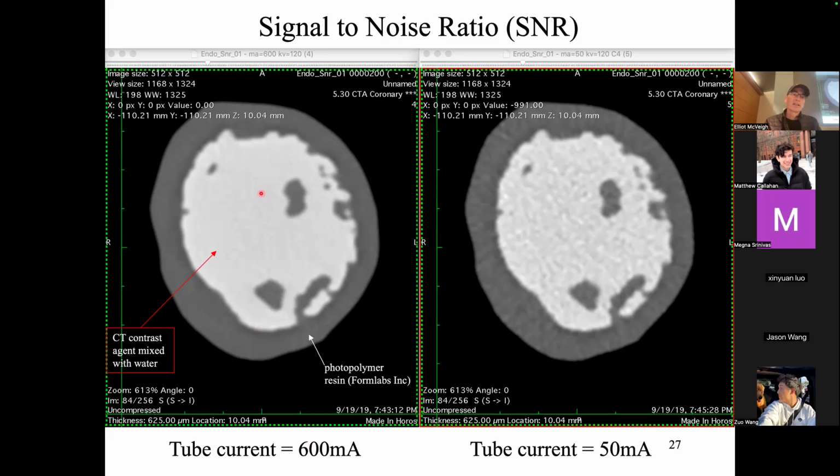We get essentially a smooth characteristic of a background that is all supposed to be the same number. This is an iodinated water, it should all be the same number. If you use far fewer photons, you can see that there's more uncertainty for each pixel about what its value is, and it just looks like noise, right? It has oscillations that are random.